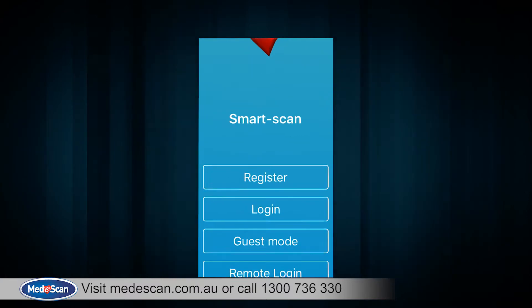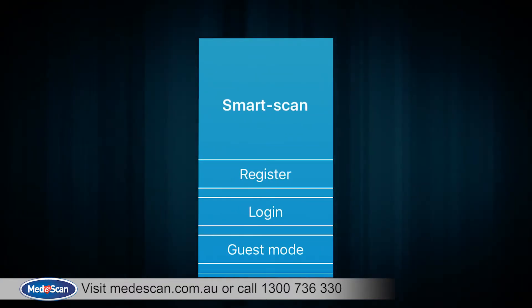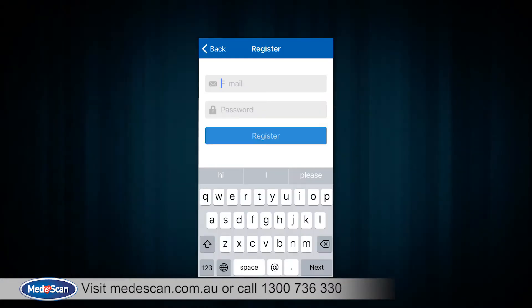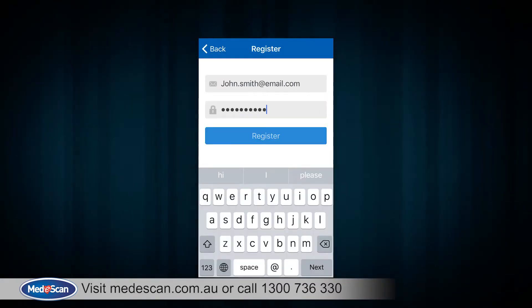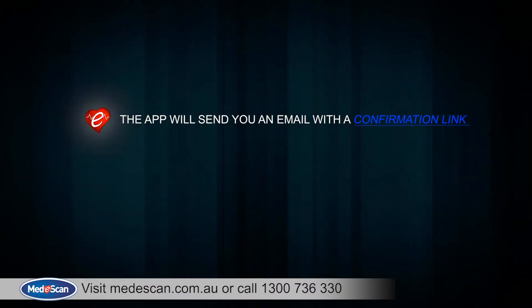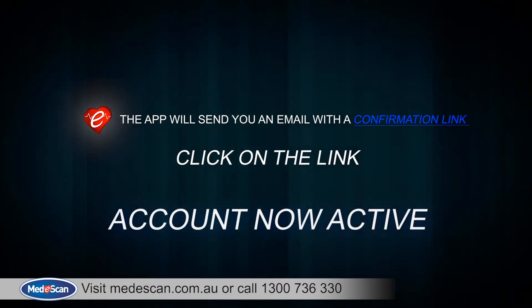Once the app is installed, you will need to register a new account. This is to enable the remote access feature that we will talk about shortly. Once registered, the app will send you an email with a confirmation link. Click on the link and your account is now active and ready to use.